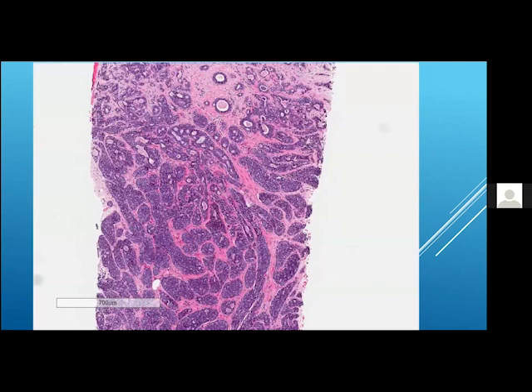And then in the same biopsy, there is an area which looks more like this, with darker cells and nests, and maybe some glands or acini in between, which in appearance resemble adenoid cystic carcinoma, if you like, within the same lesion. So what to call this at that time was a little bit of a struggle.